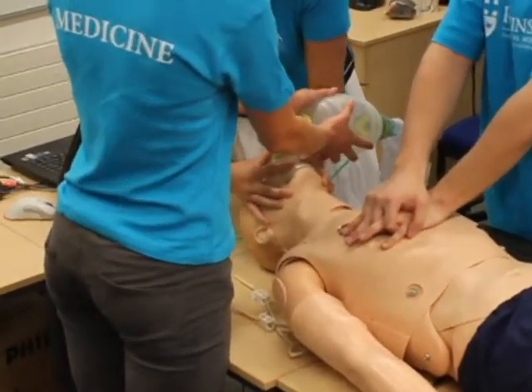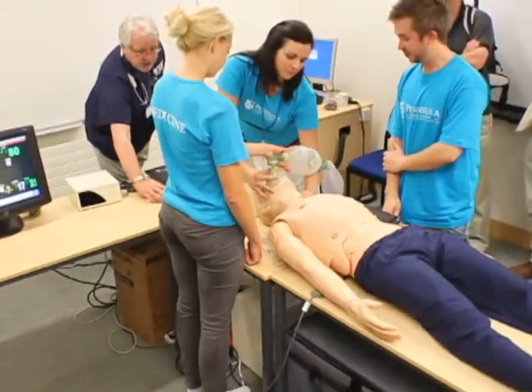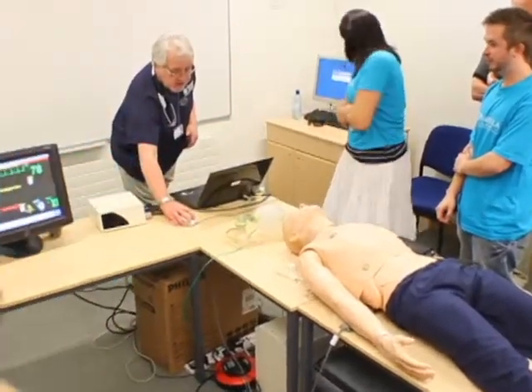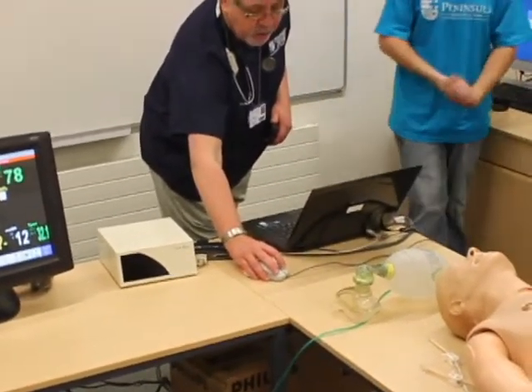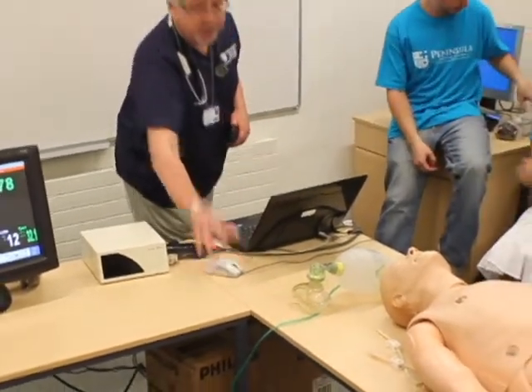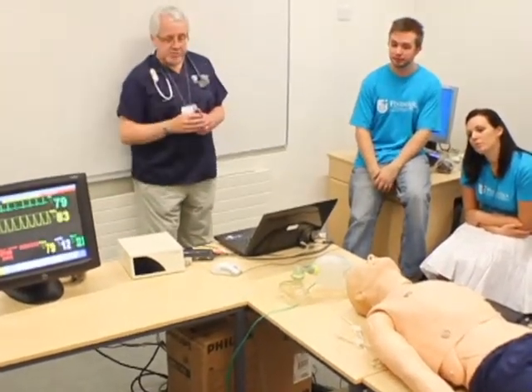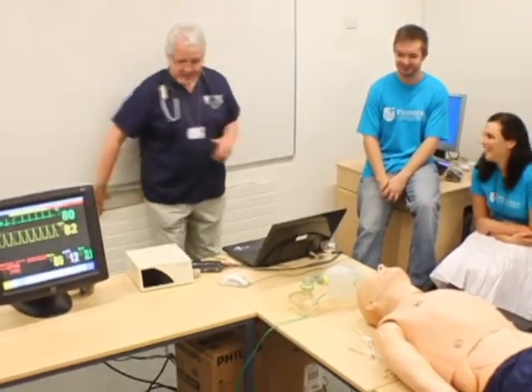And we've moved now — we've got an output. We hope. He's now got a regular steady pulse and his oxygen's going to come up. He's going to start breathing again now. All of these interventions I'm doing on the fly at the moment, but we normally would have these already pre-programmed into the computer so they would respond to these improvements. His oxygen's going up, his heart rate is steady, his respiratory's back up and his blood pressure's come back up. They've been extremely successful in their resuscitation.